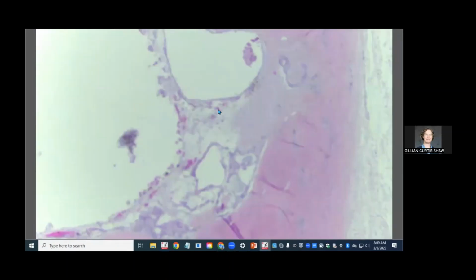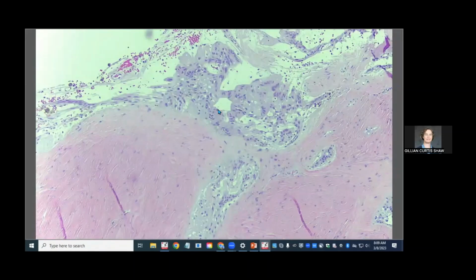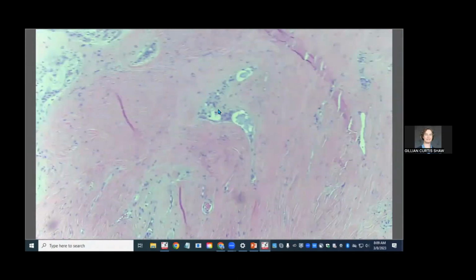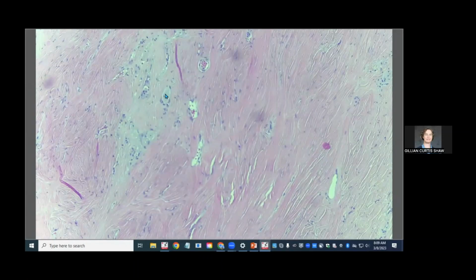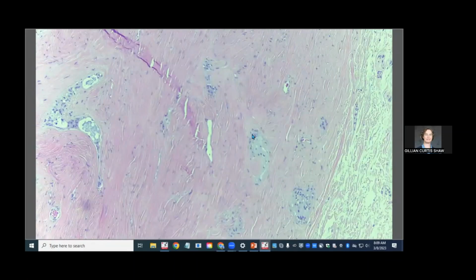And in this limbal defect, we do have a little bit of something that could either be iridociliary epithelium, or it could be retina. I'm not really sure which. It perhaps is a little bit of both and can't make up its mind. As long as we're talking about a congenitally abnormal globe, why not? And also there are some of that similar cells that are sort of embedded in the limbal sclera all the way out to here. So this is consistent with a coloboma.